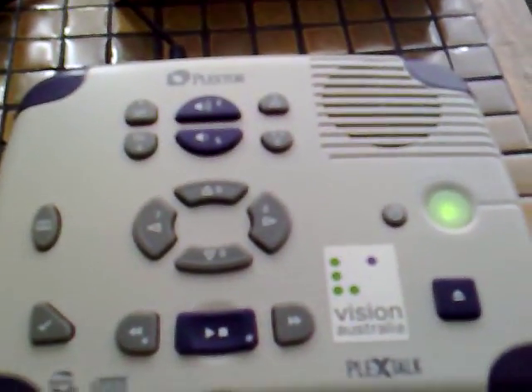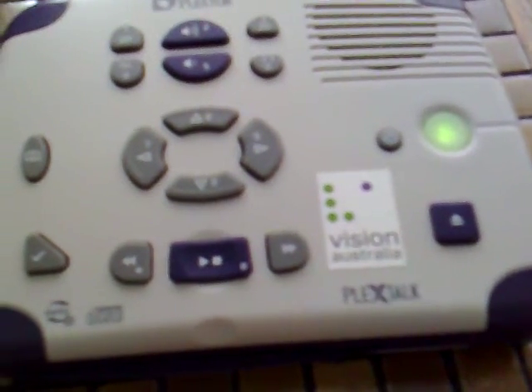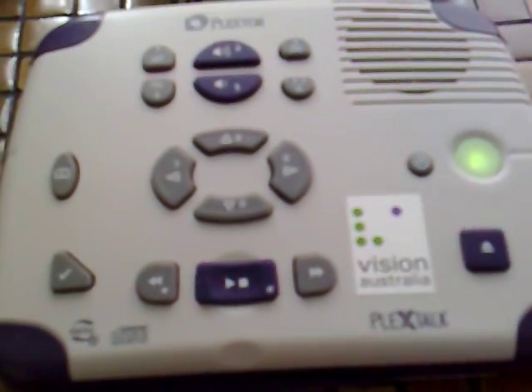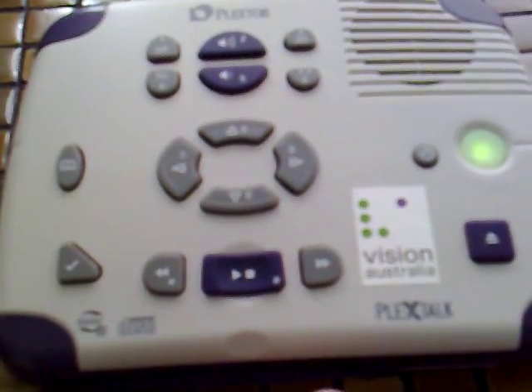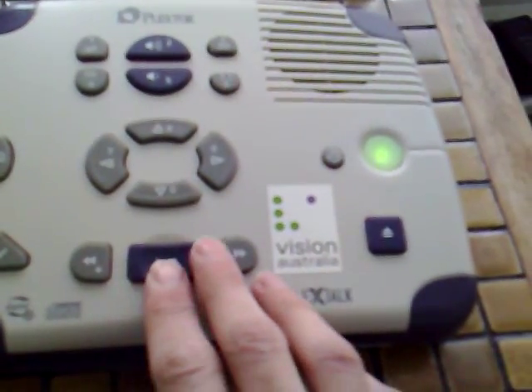We can also jump to different pages in the book, so let's press the Go to Page button. We'll go to page one and press Enter. We're now at the very start of the book. The machine reads: "This is a DAISY recording produced by the Vision Australia Information and Library Service on the 7th of November 2005, narrated by Francis Greenslade."